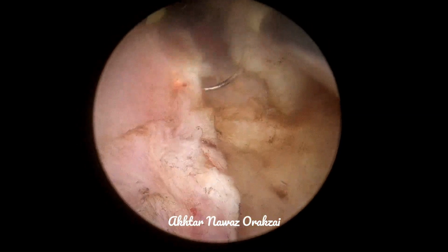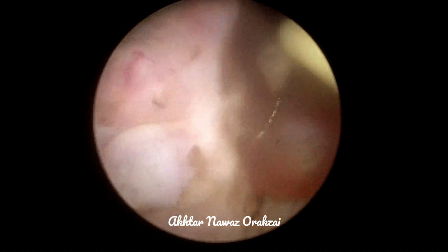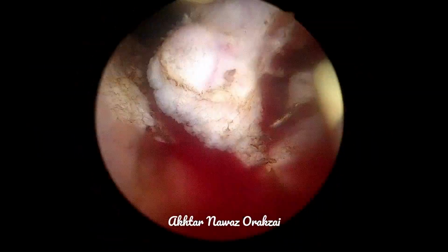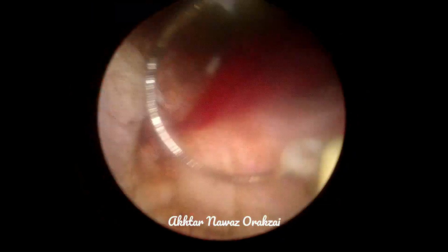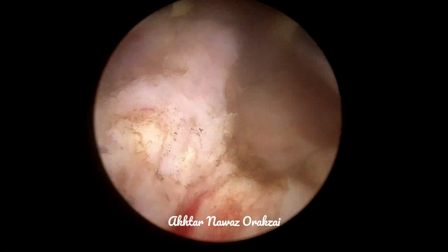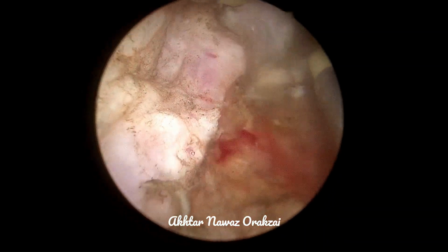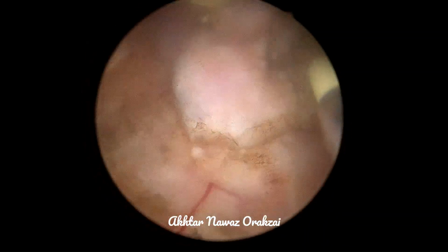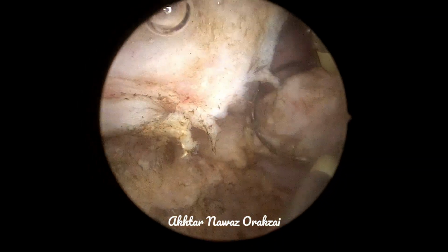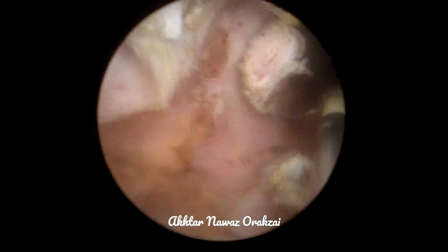So we start another session of resection. However, I'm trying not to take deeper chips this time, because we all know that we are near the capsule. You can see the small black dots, which are a sign of nearness to the capsule.